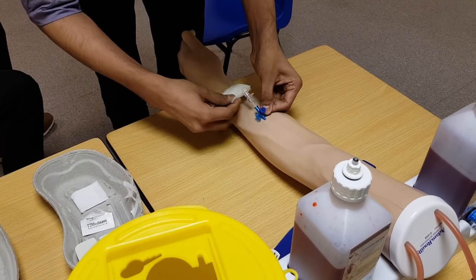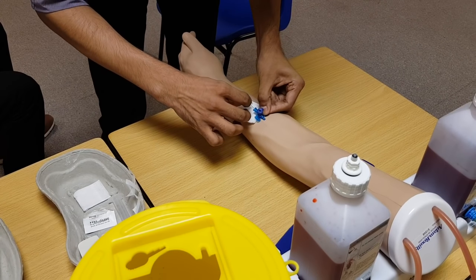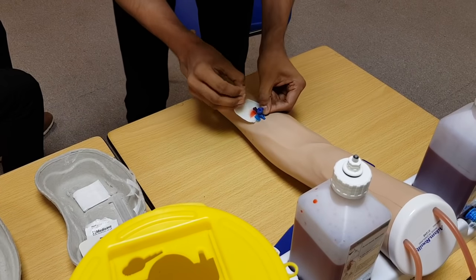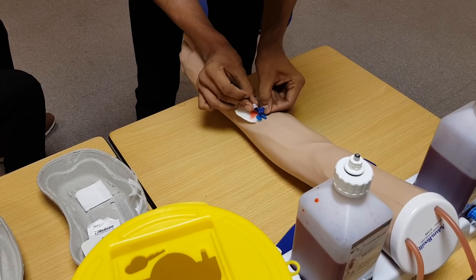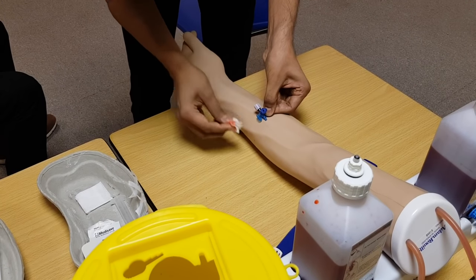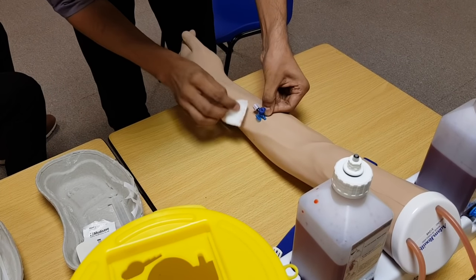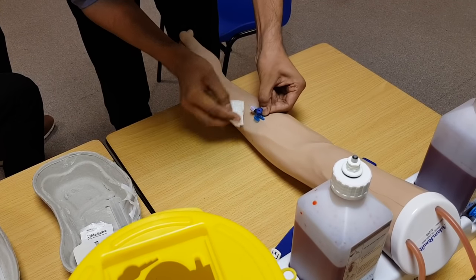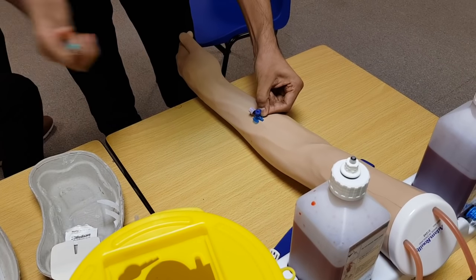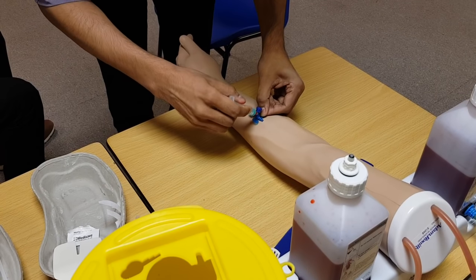Once the full cannula is inside, open the tourniquet and place a gauze piece just beneath it so that blood will not come onto the patient's hand. Then take out the needle and throw it in the sharps bin. Close the white cap. If one or two drops fall on the gauze piece, don't worry — clean it nicely, because if there is any blood your Tegaderm will not stick. Before you apply the Tegaderm, make sure to flush it — open it and just flush it.